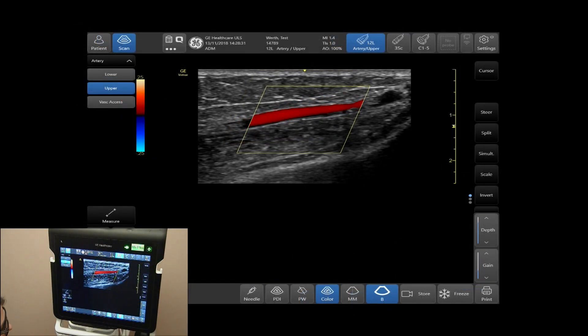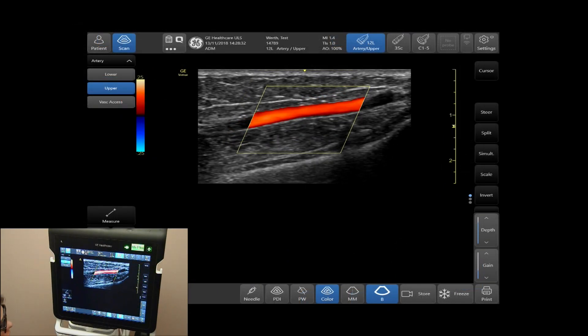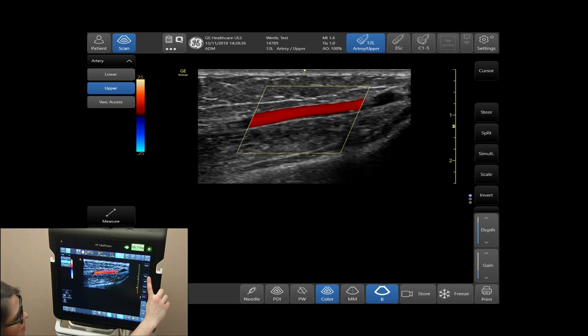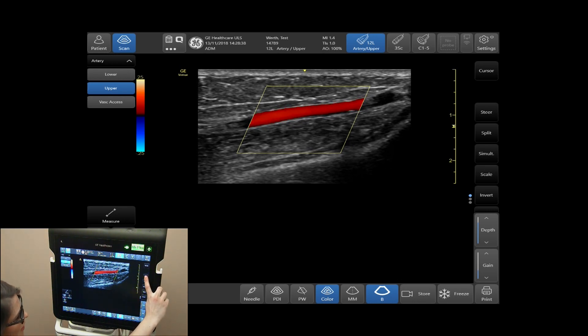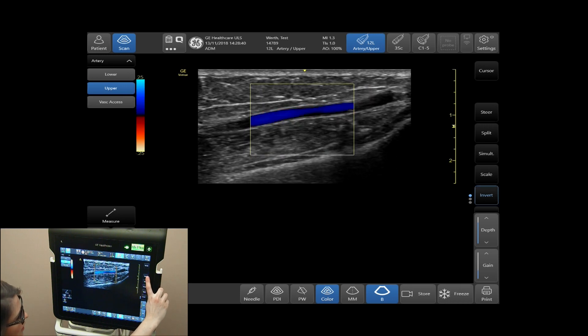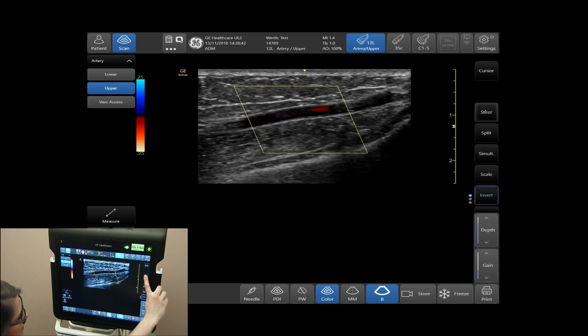To steer the angle of your box, on the right-hand side of your touch screen, select Steer, and it will steer from left center to right.